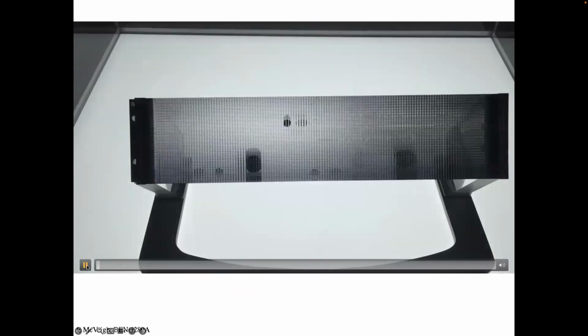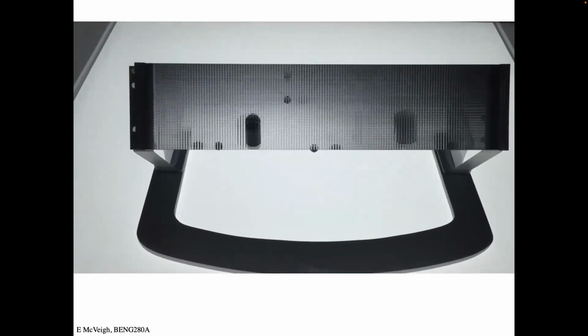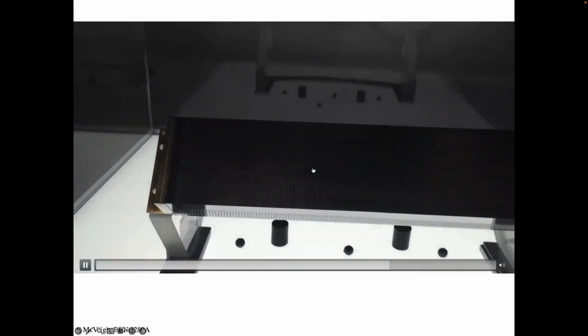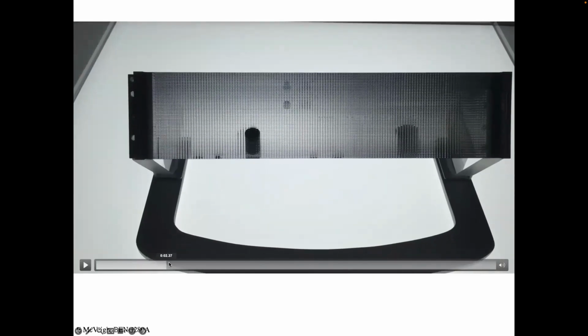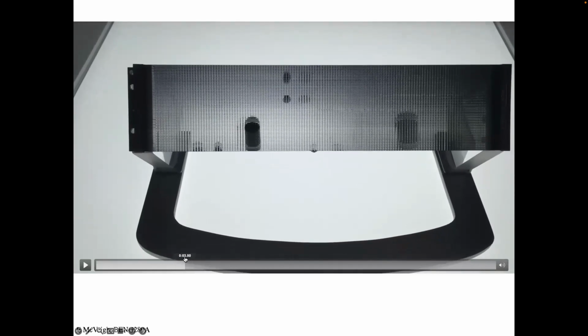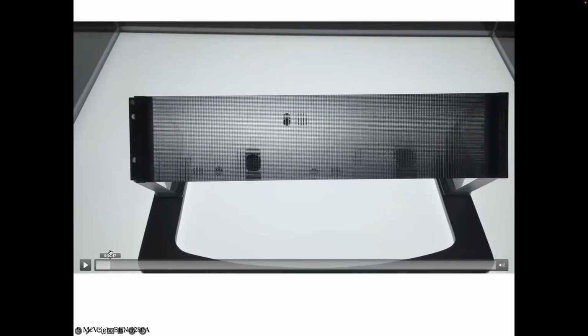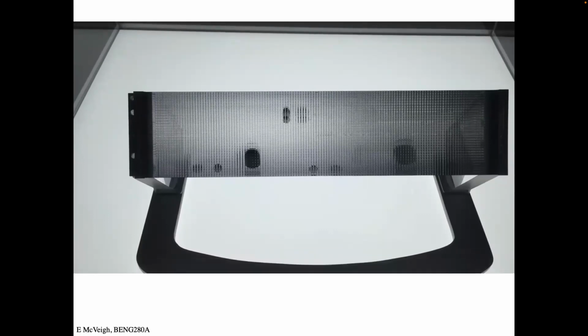This is my handheld video at the plant where I took my phone and I just passed it along over top of the thing, and you can see how things come and go. So they're all on a base here. That's what's down. But then when you look up, you can see it'll disappear at a certain angle. Interesting thing is it comes back and then it disappears again, right? It's like, what the heck? What good is that? But that's because this is light, right? And light is bouncing, so you get multiple images. But the X-rays would just disappear, right?